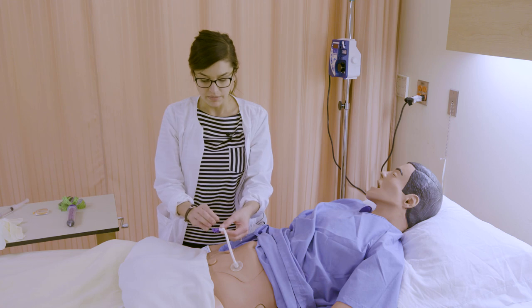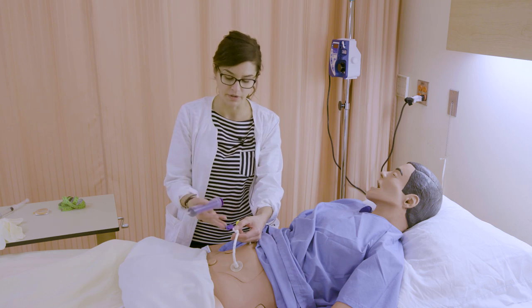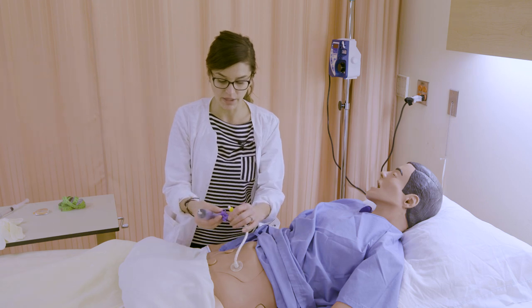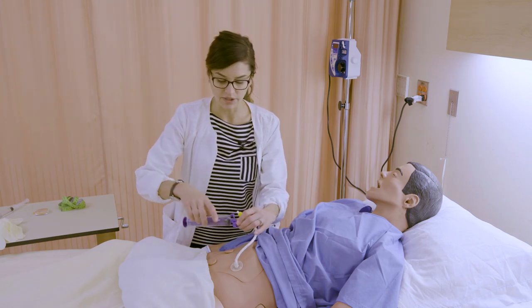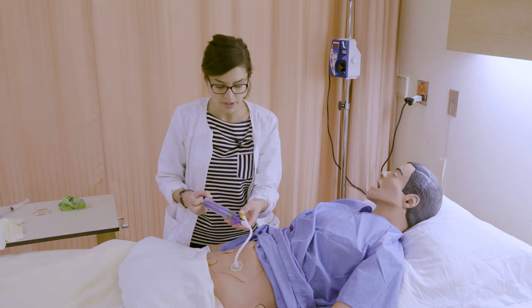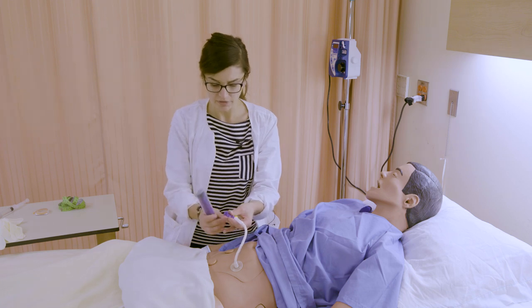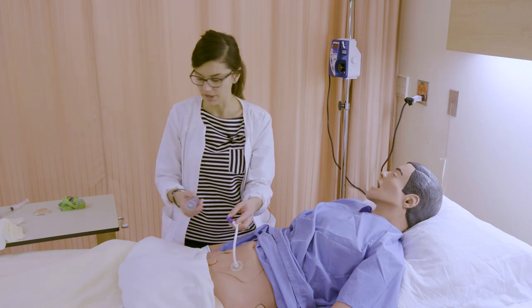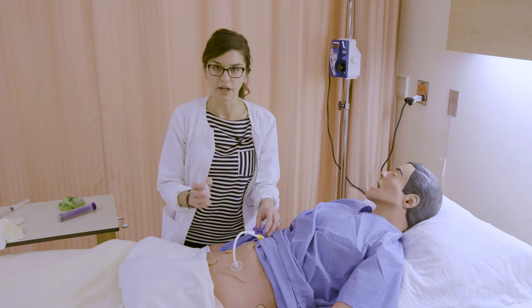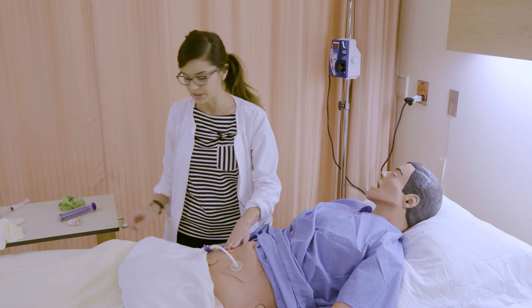Some places also require you to check the gastric pH and characteristics before accessing the tube for feedings or medications. You do this by opening the ports, inserting your syringe, and pulling back to check the gastric contents, which are typically a grassy green color with a pH of about 1 to 4 or 1 to 5 depending on the age of the client. You'd want gloves, pH strips, a med cup to test into, and maybe a towel by the patient.